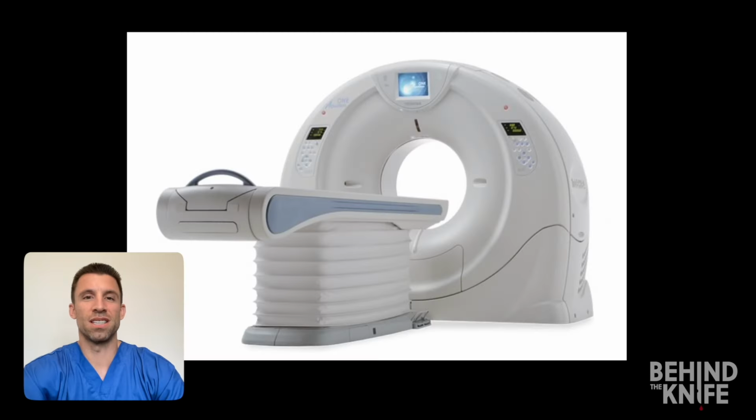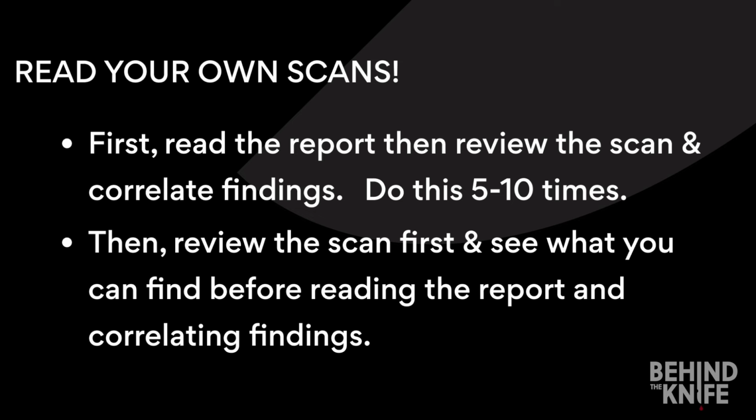In fact, we look at so many scans over time, the surgeons become quite adept at interpreting their own images. Now, if you want to dominate your surgery rotation, you really should learn how to read a CT scan. It's not only useful in surgery, but for so many other specialties as well. And to that end, we recommend you look at as many scans as possible.